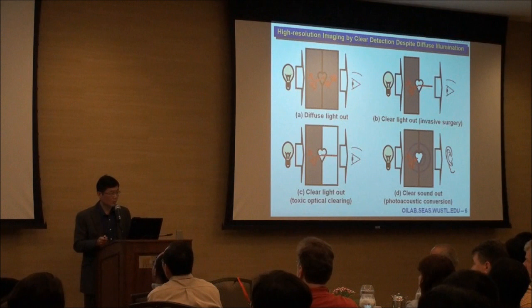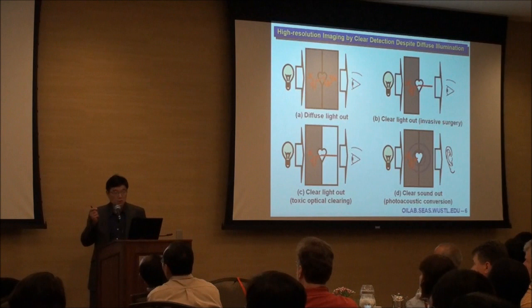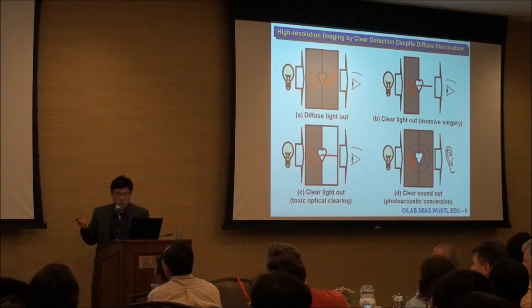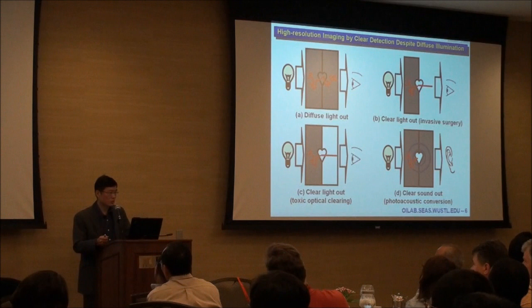So here, we're simply listening to the sound induced by light. Light is absorbed, which is converted into sound through the photoacoustic effect. So you're listening to an optical structure instead of looking at one. Right? This is the power of this technology.